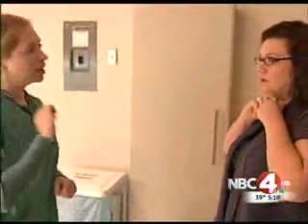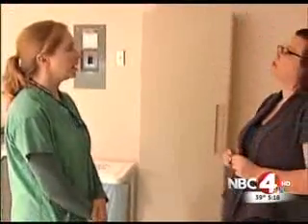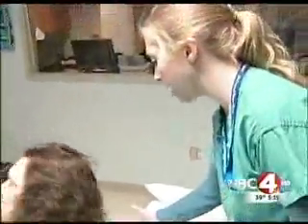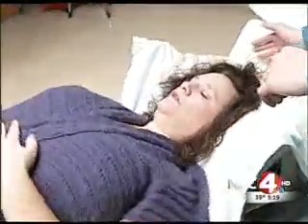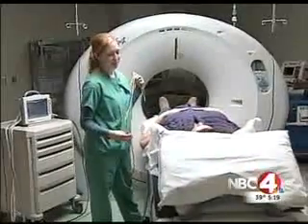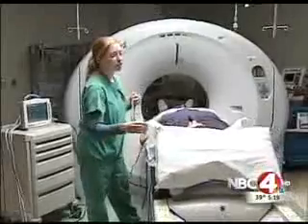She's nervous because... Family history of heart disease? Yes. What kind of family history? My dad had 2 heart attacks within a month after his 56th birthday. That's pretty young, yeah. And my grandfather dropped dead at the age of his early 70s. But she's hoping this scan, these machines, will clue her in to some small chest pains she's had over the past few years. After removing any metal jewelry, she's in place for the test.